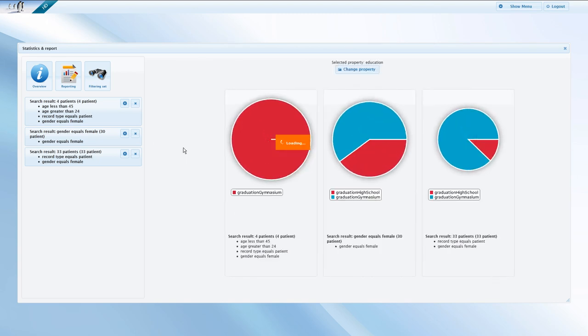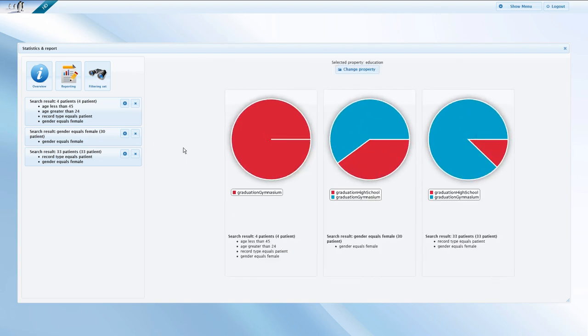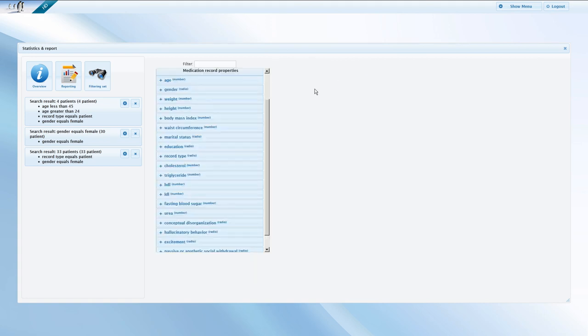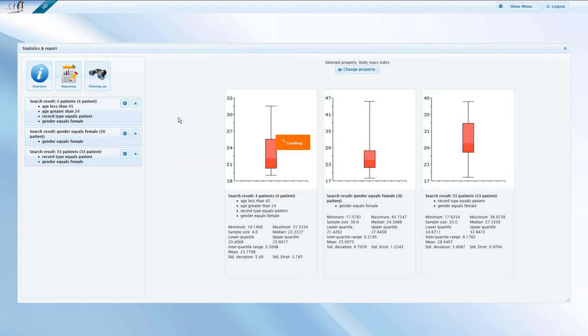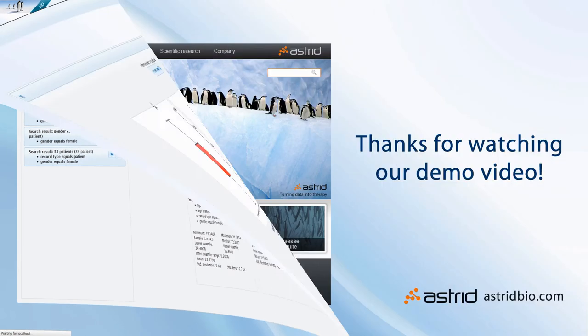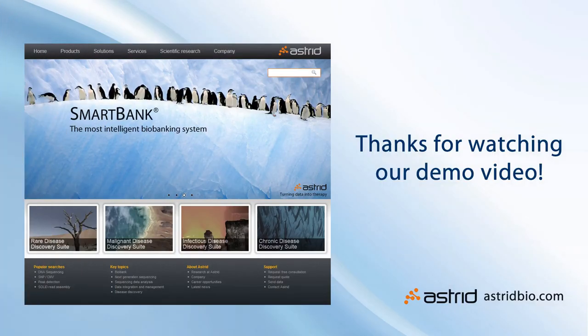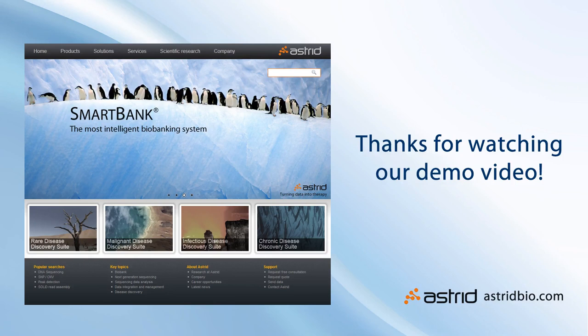This tool enables you to establish hypothetical connections, prove or disprove relations between any variables. The combination based on freely picking criteria and properties are only limited by your imagination. We finish our demonstration by logging out of SmartBank. For more information, visit the Astrid website at www.astridbio.com or contact our team. We will be happy to help you.